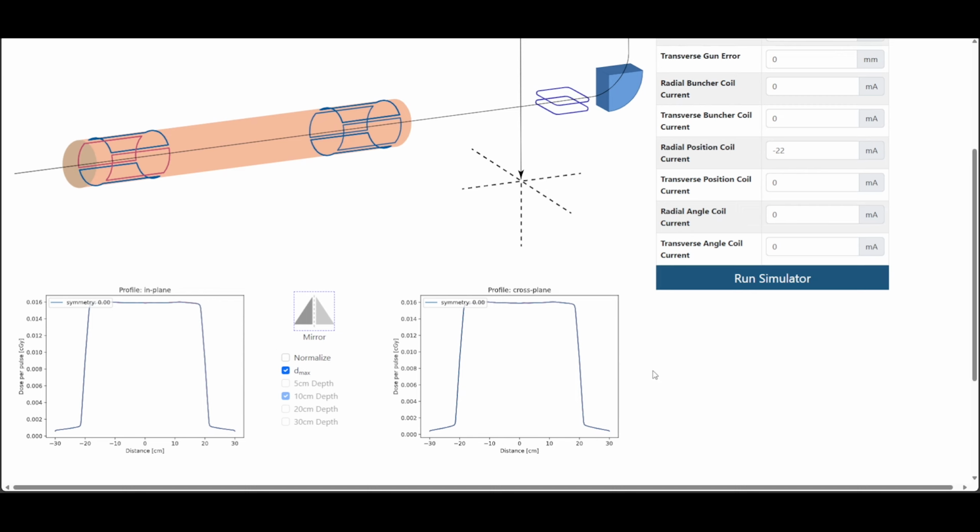Okay, great. We steered our beam and were able to investigate how the different magnets affect the symmetry. If you want to learn more, you can use Simac to practice beam steering.